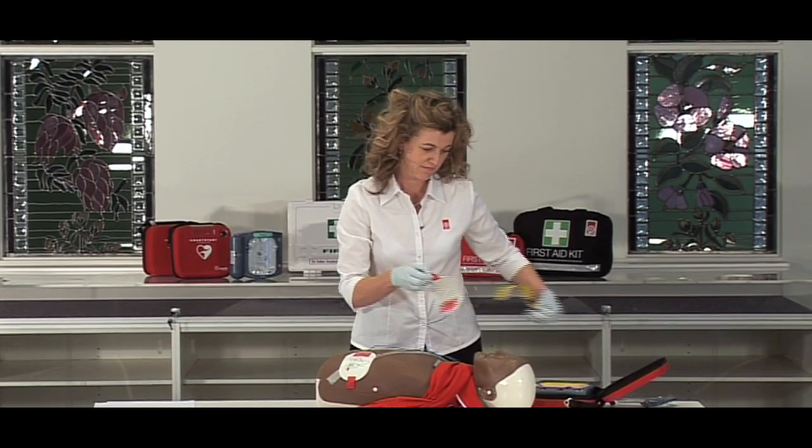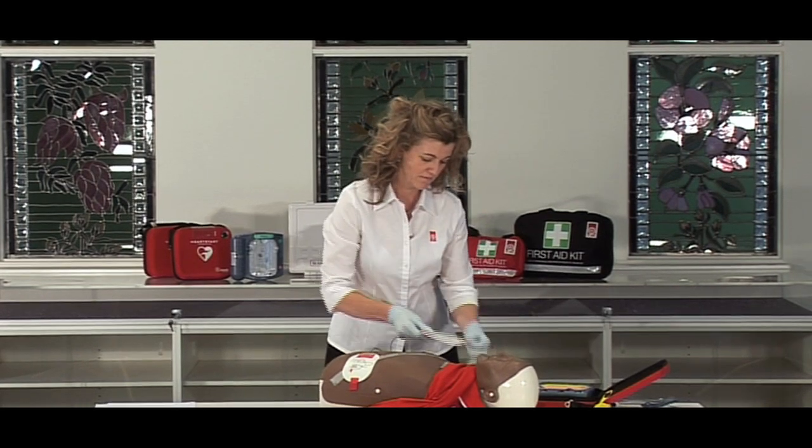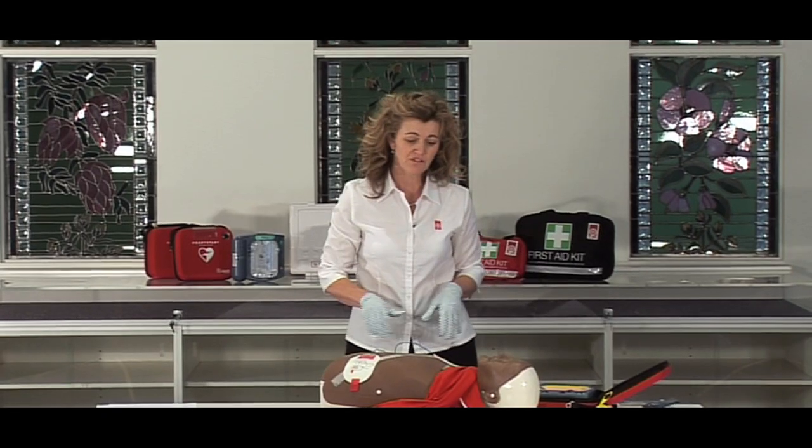When the first pad is in place, look carefully at the picture on the second pad. Peel the second pad from the yellow liner. Ensure no one is touching the casualty.